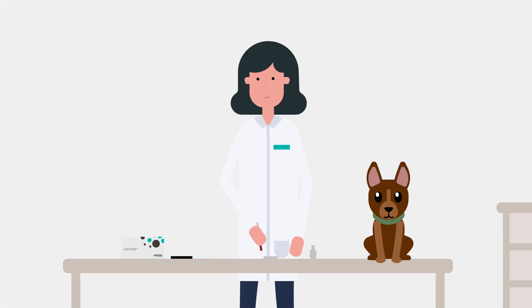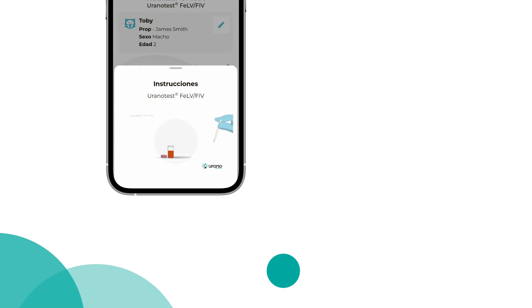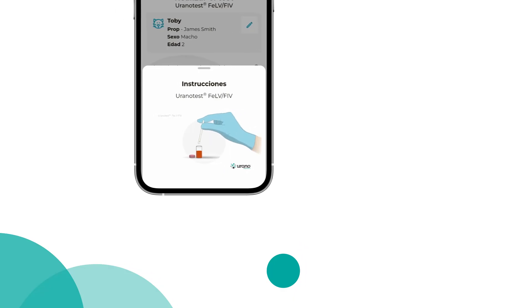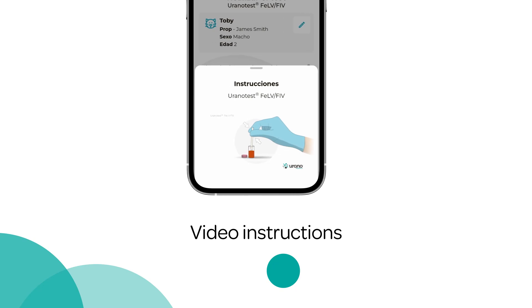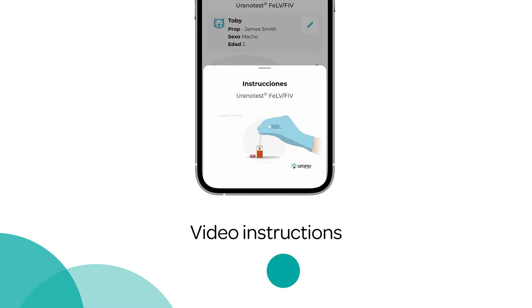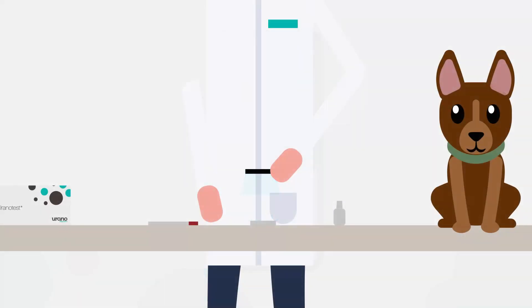Perform the Urano Test following the instructions in the information leaflet. If you have any doubts about how to conduct the test, the app has step-by-step video instructions. Once the necessary time has passed, read the test with your phone's camera.